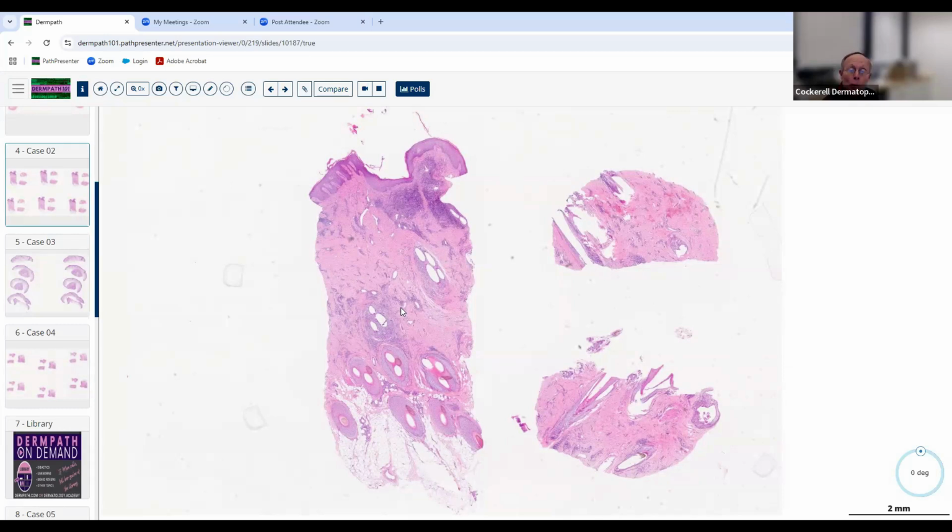And then you can say if it's a permanent inflammatory alopecia, then you say, well, is there scar tissue and inflammation or no scar tissue and inflammation? And if there is scar tissue and inflammation, where is that localized to? Is it targeting the follicle? And if it is targeting the follicle, which part of the follicle is it targeting? Is it targeting the bottom part of the follicle, like in alopecia areata, for example, where it's targeting the bulb of the hair follicle? Or is it targeting the upper part of the follicle, like maybe near the infundibulum and the isthmus in that area?